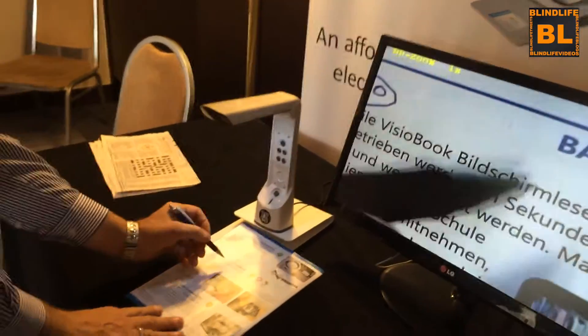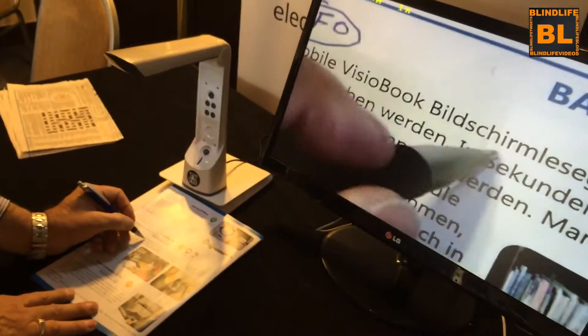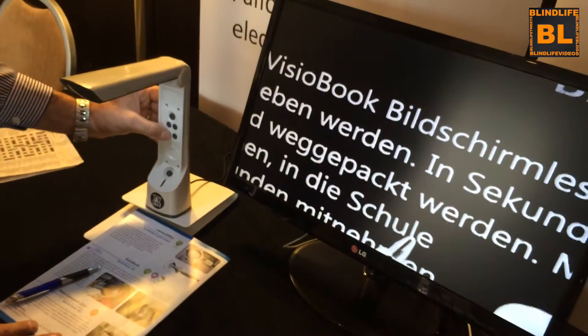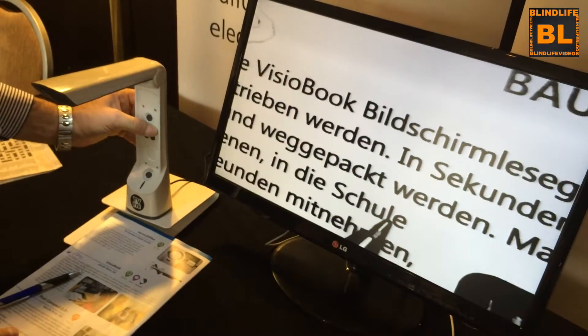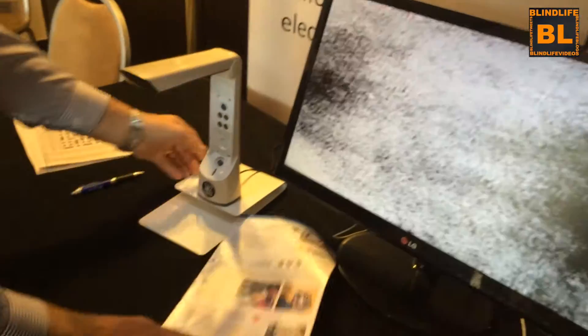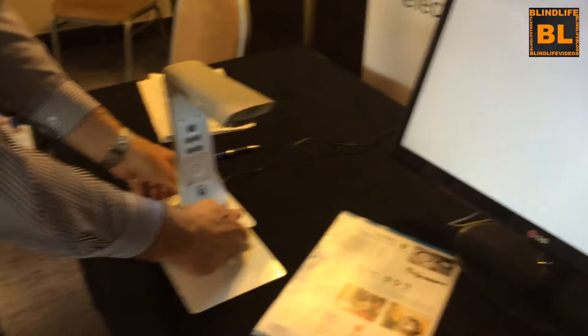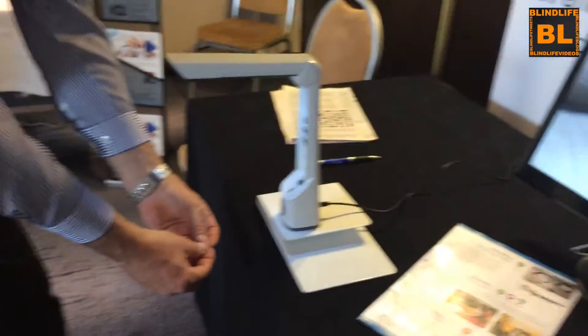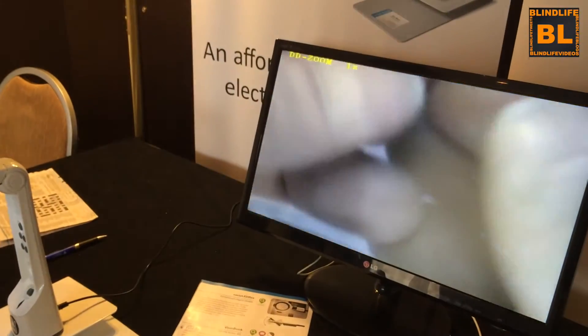And you can write underneath here quite easily. You can make the magnification bigger. You can make it in the negative or the positive. And you can use it practically as well. If I bring it to the side, then I can work underneath quite easily.